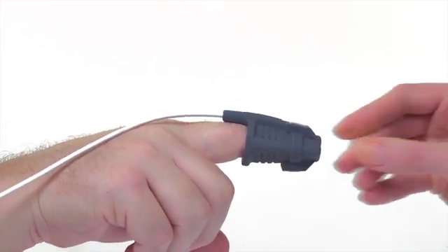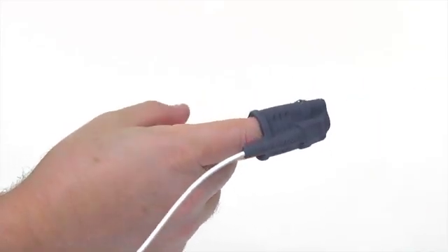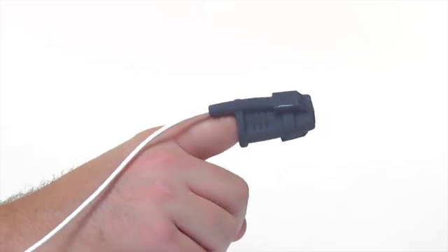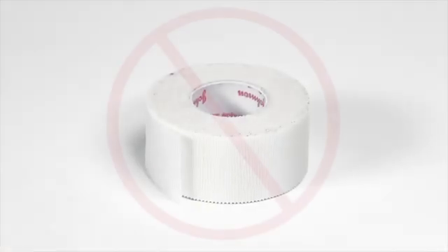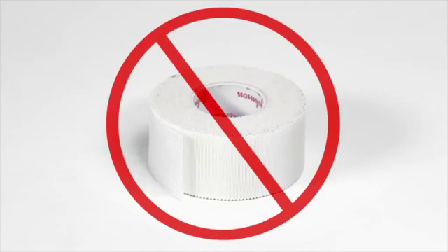Soft sensors position on the finger without tape or adhesives. They may also be used on a toe of the appropriate size for the sensor size. Additional adhesives or tapes will not properly position the sensor and may cause signal problems or sensor damage.